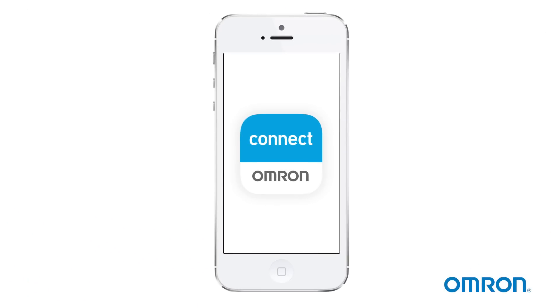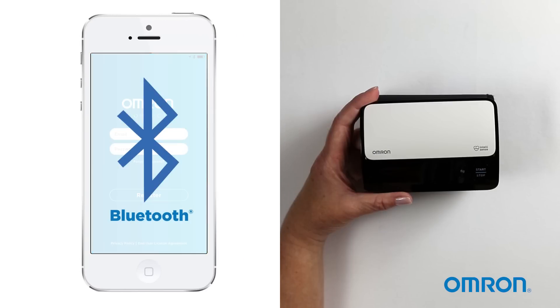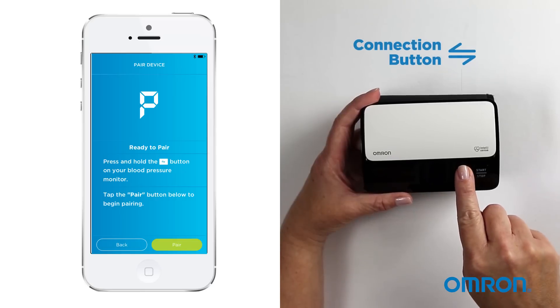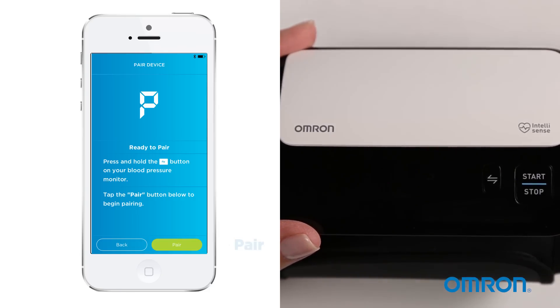Now download the Omron Connect app to your smart device. Next, pair the devices. To do this, turn on your phone's Bluetooth. Open the Omron Connect app and press the connection button on your Evolve for five seconds. Then tap the pair button to complete the setup.